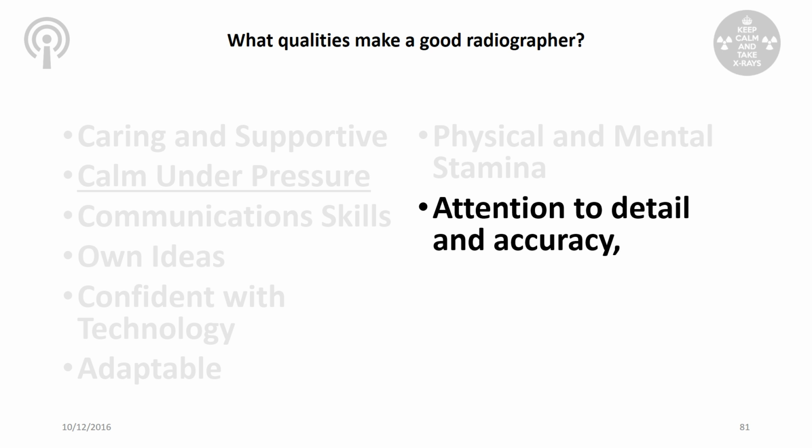We have plain film audit, which looks at the quality of images from reporting radiographers. Reporting radiographers do the actual reporting itself, and reporting is basically having an official comment from somebody that is trained in the interpretation of radiographic images.